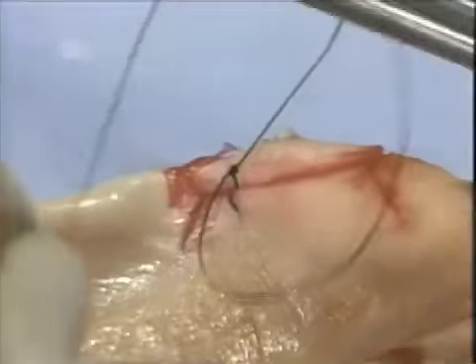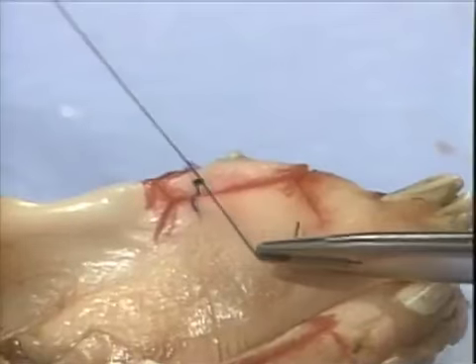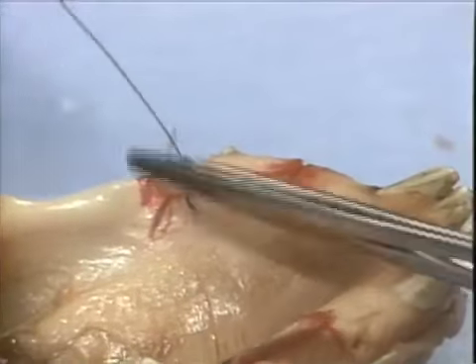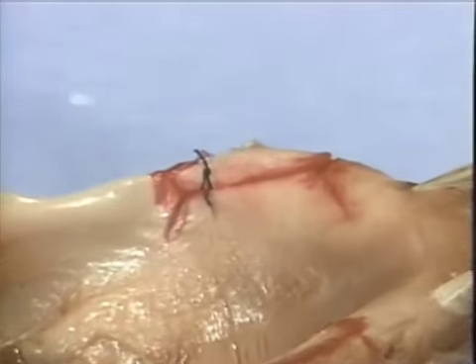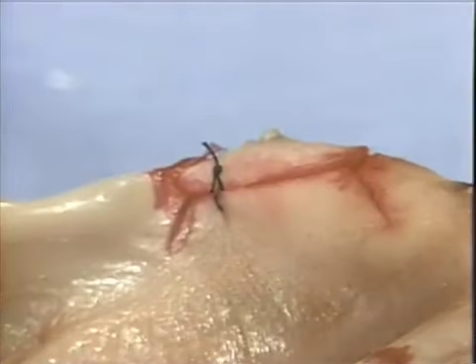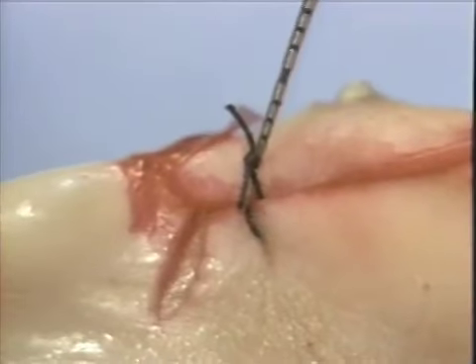Again, this suture forms a figure-8, where the crossover portion of the figure-8 lies within the incision. Where primary adaptation of the buccal with lingual flap is desired, this intervening suture material is contraindicated.